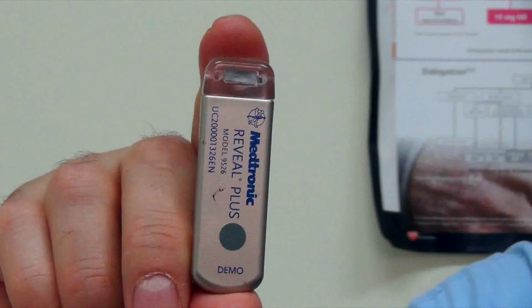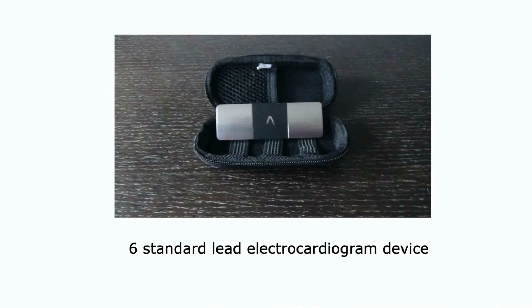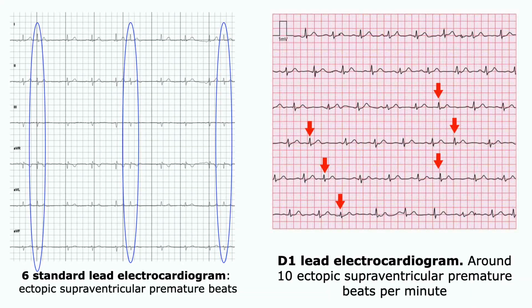Rather than implanting a loop recorder in such a compliant patient, strict self-monitoring with a 6 standard lead electrocardiogram device was carried out for 2 years. Although no atrial fibrillation was ever detected, premature supraventricular beats persisted with minor discomfort. Thus, flecainide was added to the metoprolol, but unsuccessfully. Conversely, anticoagulation therapy was discontinued after 6 months from ablation, since the patient had suffered no structural myocardial complications.